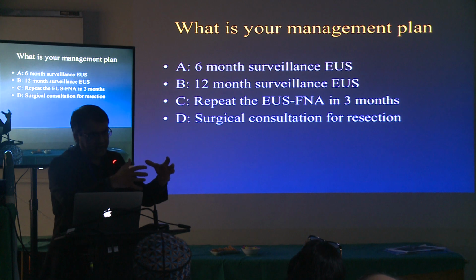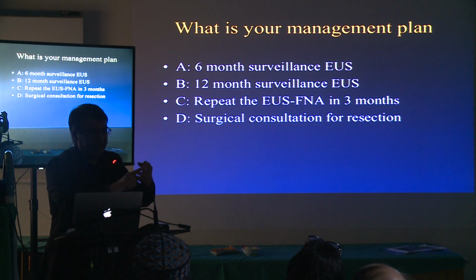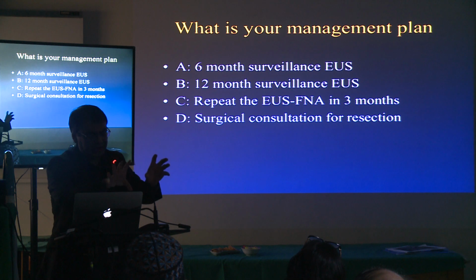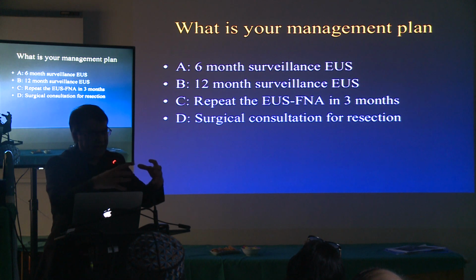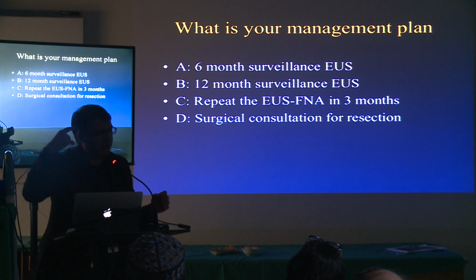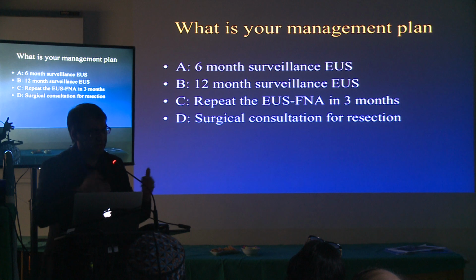And what causes a compression or post dilation? Either it's going to be a mass or a stricture or a blockage from anything, right? So whenever you see something hypoechoic like that, a little bit irregular, there's what we call a post-obstructive dilation of that. So you start wondering whether it's really an early tumor, early cancer or something like that.